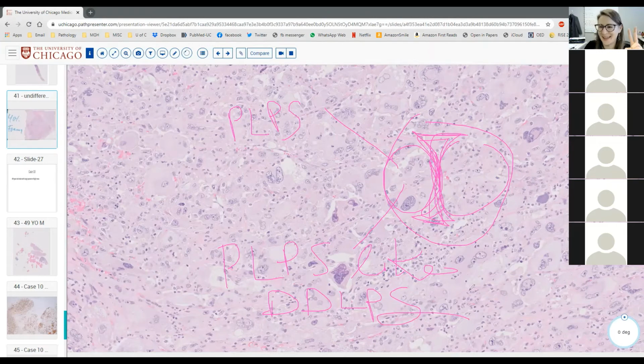Okay. And in this case, what's going to be your genetics? Right, we have the MDM2 CDK4. So true pleomorphic lipoblasts can be seen in pleomorphic liposarcoma, complex nonspecific karyotype, and pleomorphic liposarcoma-like areas of a dedifferentiated liposarcoma. So you always want to do the MDM2 if you think you see true lipoblasts. In this case, I believe the MDM2 CDK4 were done, and they were still negative because this isn't that.